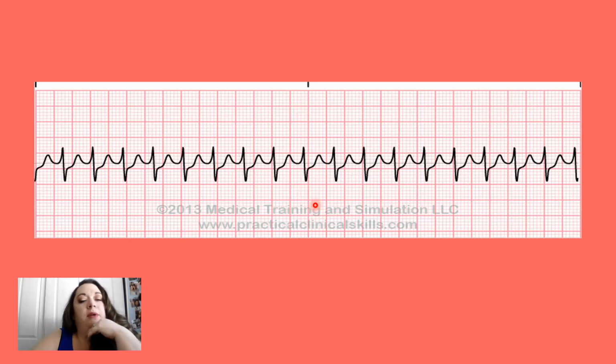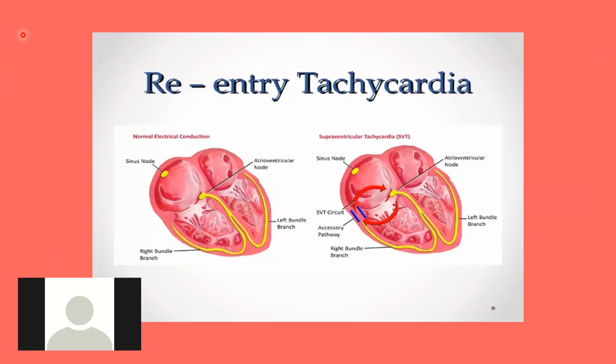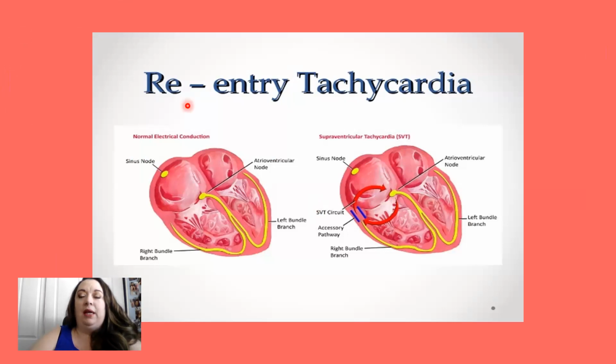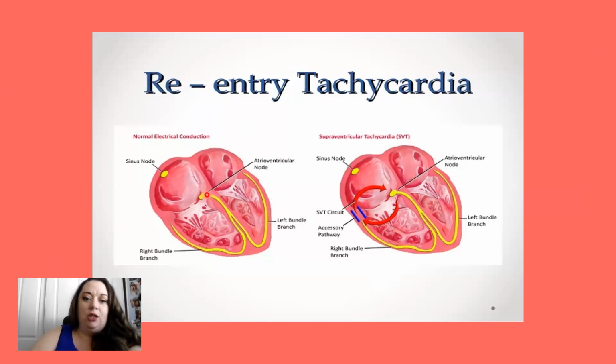And then if that doesn't work, what can we do? Any guesses? I know somebody's got to know this. Would it be to shock? Yes, you're going to shock them. So when we shock them, are we defibrillating or cardioverting? Cardioverting? Perfect, cardioversion.